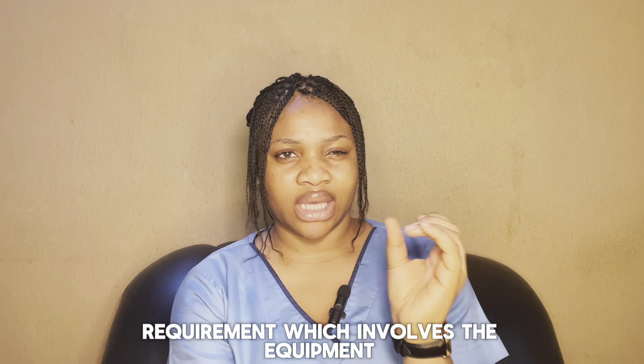So these are the sterile gloves you need. And then obviously you need a cannula. The cannula, you need different sizes of cannula. If the patient's vein is a tiny vein, make sure you use a small one. If you want to know, just go back to my first video and watch part 1.